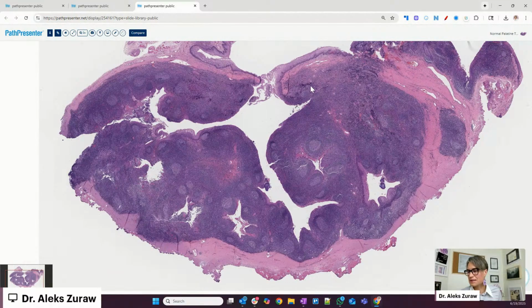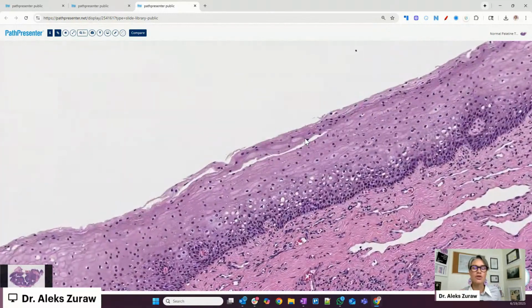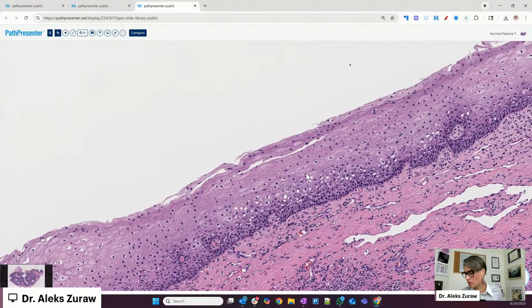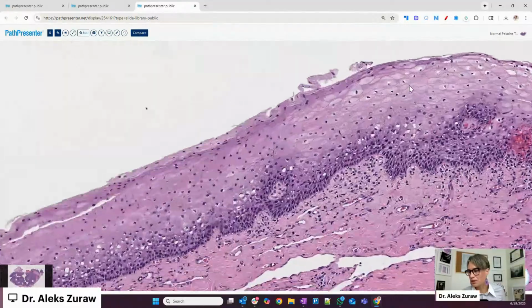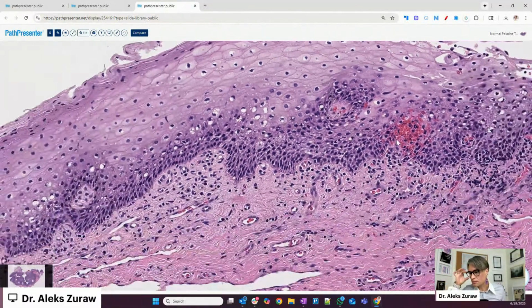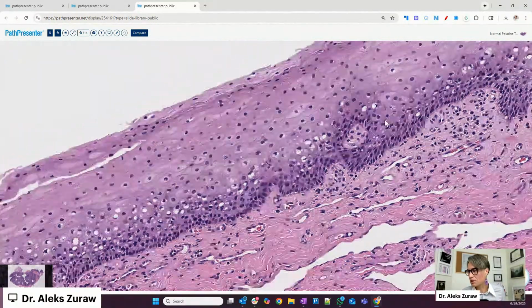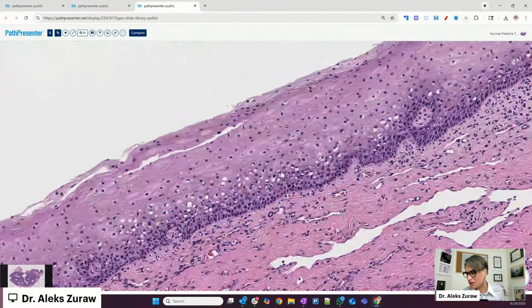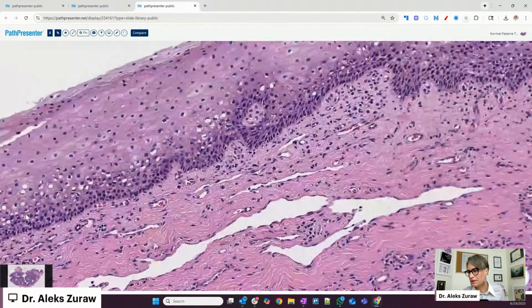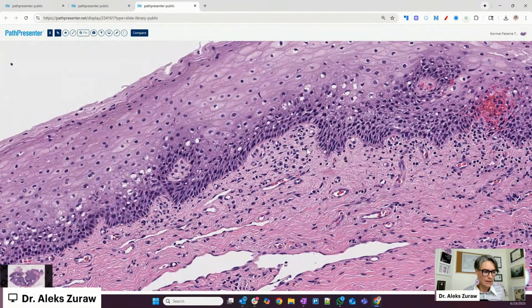But what we have here is this epithelium and the palatine tonsil. We have also pharyngeal tonsil and tonsils on the tongue, so lingual or tongue tonsil. And they will not have this epithelium, and it looks so cool. And you can see that we have a similar structure to what we had on skin, because it is actually skin, but it's a mucous membrane of the inside of your palate, right? We had this basal structure. We had the papilla from the dermis going in.